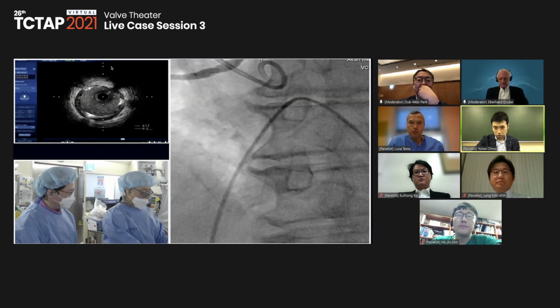According to the angio alone, the RCA stenosis is not so tight. If the patient is not presenting acute coronary syndrome, I would skip coronary PCI, just do TAVR, and send him to the thoracic surgeon without any antiplatelet therapy.